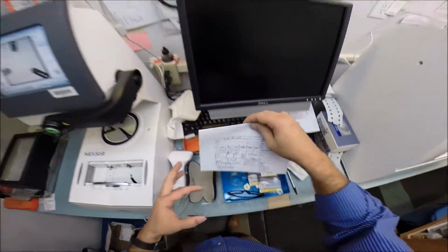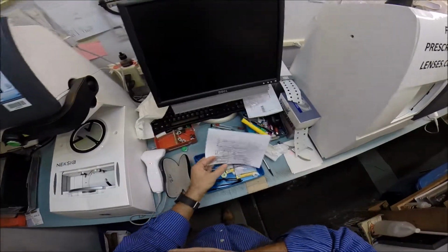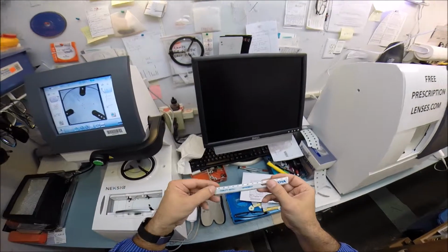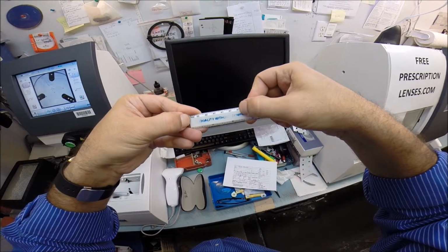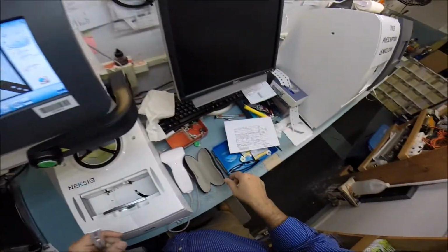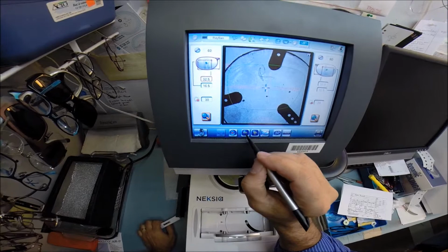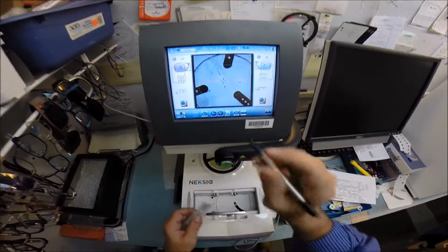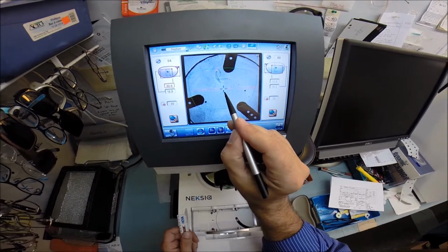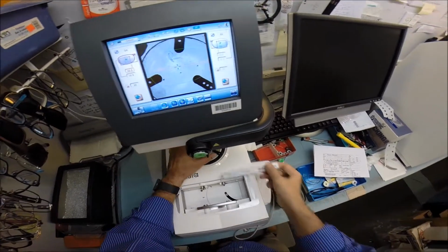Of course, your pupillary distance is 60 divided in half. That is the distance in millimeters from the center of your pupil. So from one thumbnail to the other, that is the exact distance from the center of your eyes, with 30 being in the middle. So where's my stylus? This is where your pupillary distance goes. I'm going to bring that down to 30 in each eye. And the blue cross is the geometric center of your lens. This is where your optical center is going to be.